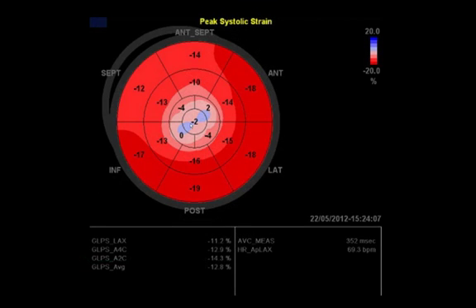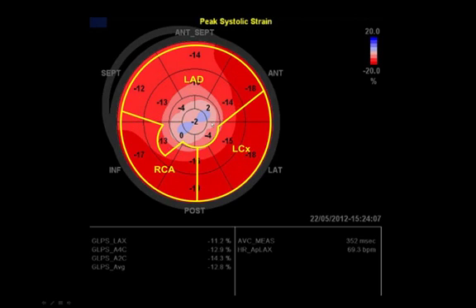And if you know from what I've said where this is going, you could clearly know already by looking at something like this that the next image I'm going to show you, I'm pretty sure some of you already predict what's coming. This is obviously an inlay of what an infarct looks like, and for the different territories, LAD, RCA, circumflex, this is where you would see the defects.